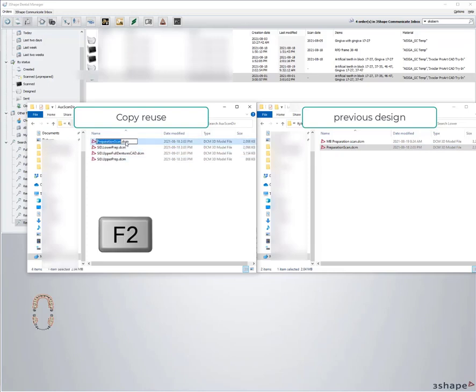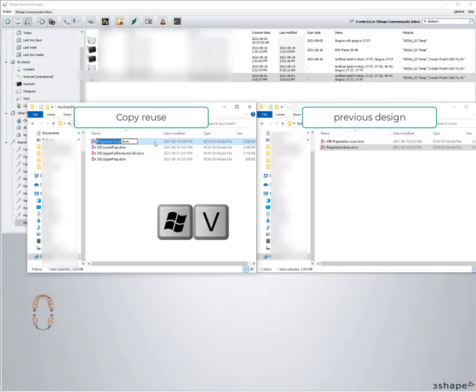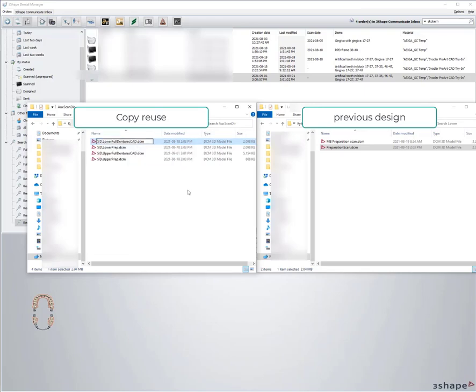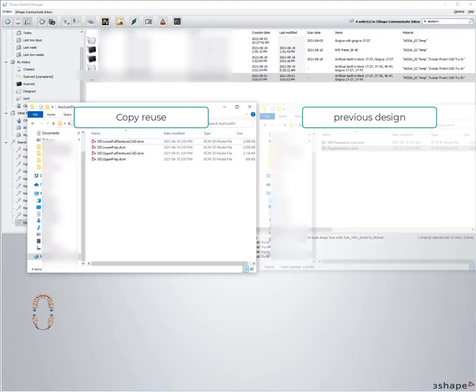I'm going to hit F2 to rename, hit Windows V to pull from my clipboard and just rename that to the original name. Essentially I've just swapped out the files for a new model.